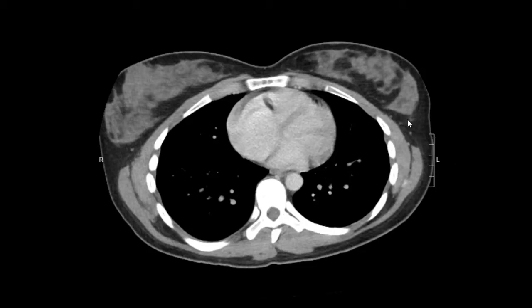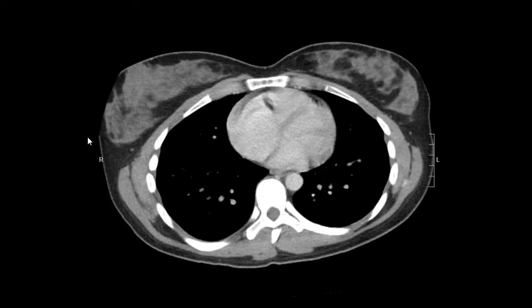Hi everybody. Today we're going to be going over a normal CT exam of the abdomen and pelvis with IV contrast. Just a disclaimer: in radiology, our right is the patient's left and our left is the patient's right. Just a reminder — this is the left side and this is the right side.